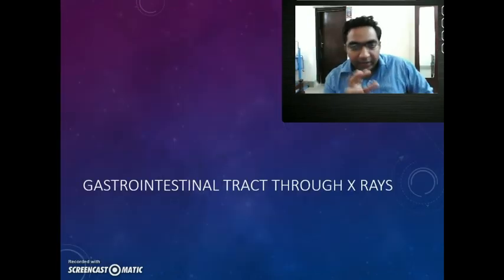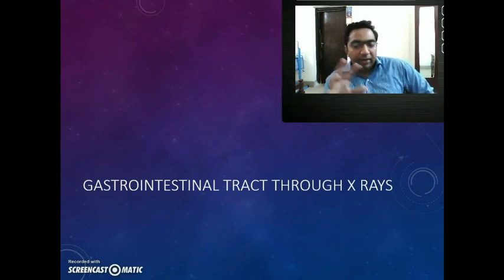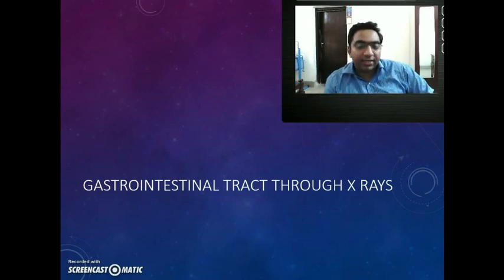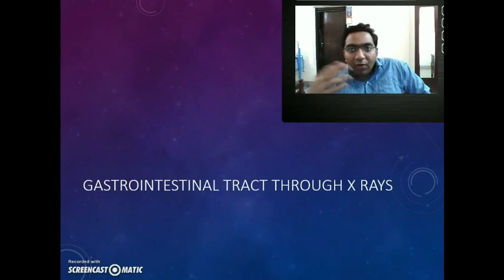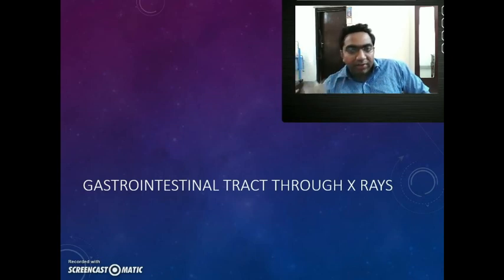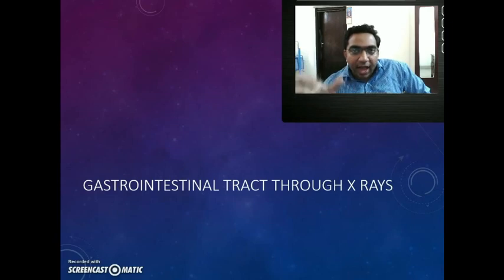Now that we have identified how to visualize a pneumoperitoneum and understood its importance as perforation peritonitis, and how to identify multiple air fluid levels suggestive of intestinal obstruction, we will try to read the multiple shadows — the multiple black shadows — we see in the abdominal X-ray erect. This is the gastro-intestinal tract in abdominal X-ray erect, and in the following part of the presentation we will use both supine and erect X-rays to identify the GI tract.